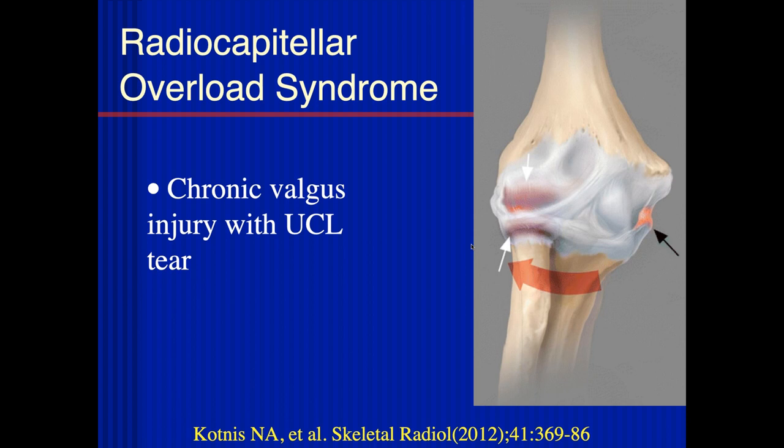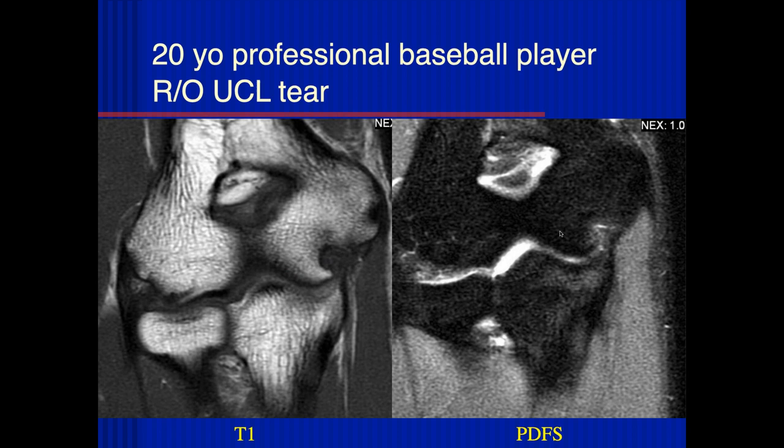Another syndrome people talk about is radiocapitellar overload syndrome, which involves chronic valgus injury in the setting of an ulnar collateral ligament tear. Looking at this case of a 20-year-old professional baseball player with an ulnar collateral ligament tear, I see edema in the region of the humeral attachment as well as maybe some edema in the sublime tubercle.